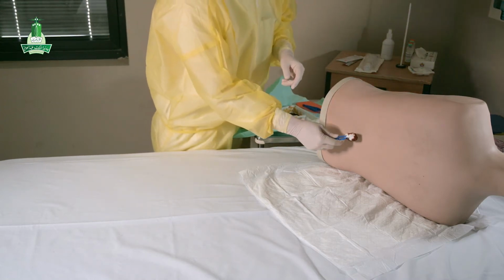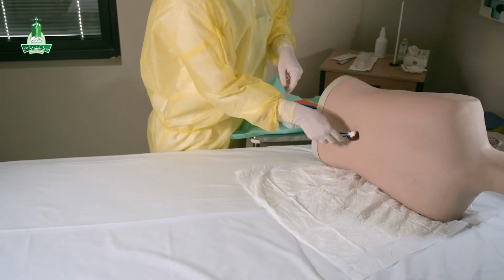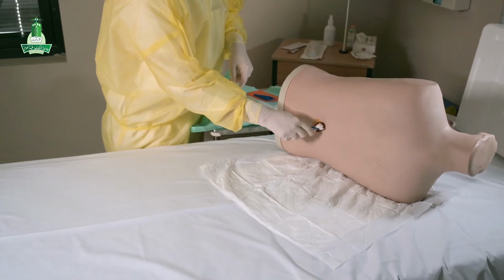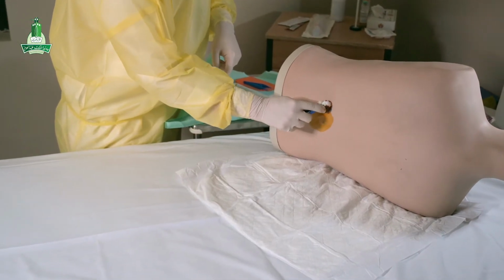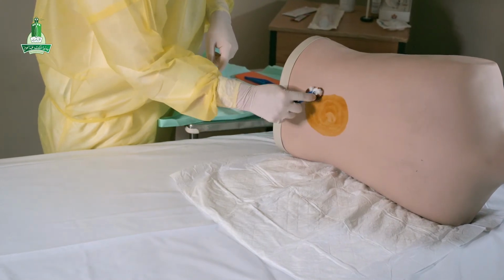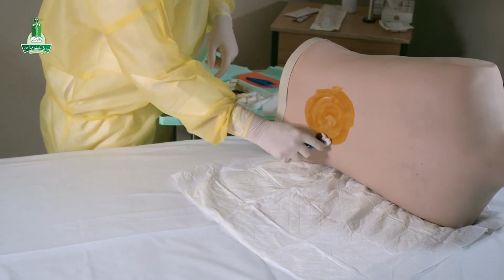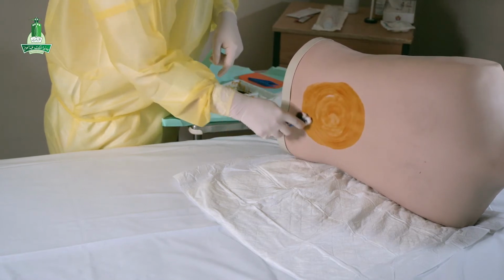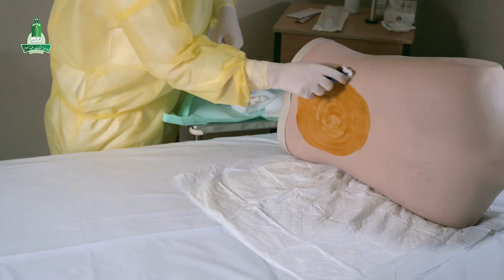the povidone iodine, starting from the center of the procedure. Say this is the site of the lumbar puncture. We'll start here. And you move it in circular motions this way, from the center to the outside. Never go back. Never do this again. Always in circular movements, going outward.